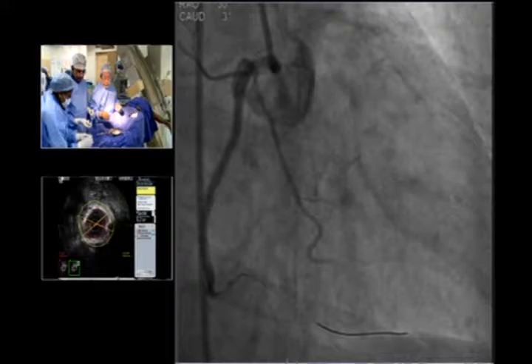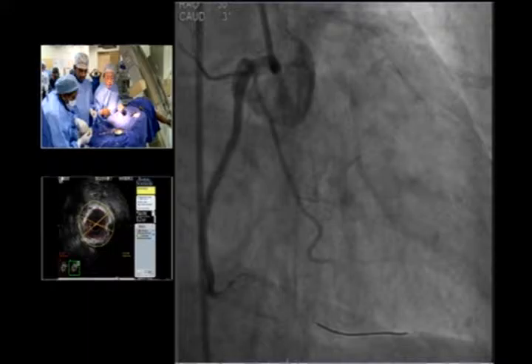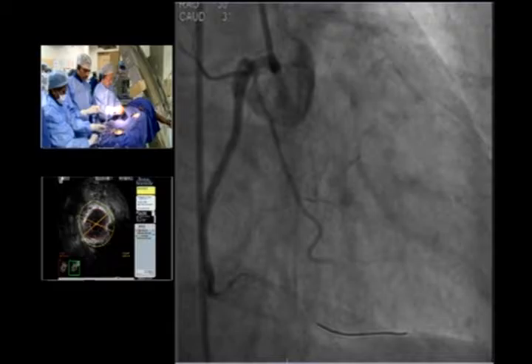Sometimes it works. It is big right, and here should be connections. So, surfing septals if the antegrade is not successful.